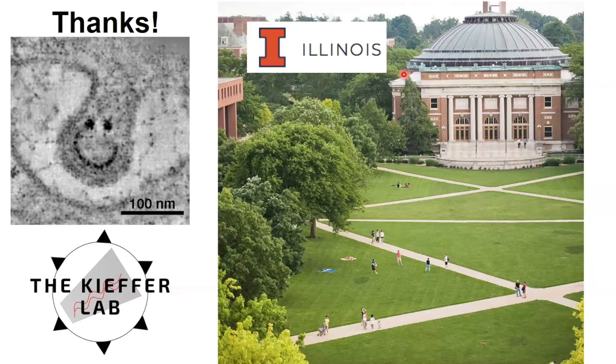I don't know if this helps or not, but all of these tissues were fixed in a higher percentage of paraformaldehyde, because we wanted to fix everything identically for both EM and light microscopy. I don't know if that's helping out some of the epitopes, but we find antibodies that work, and that's what we go with. We pay the various companies, try out five of their antibodies, and when one works, that's what we go with.